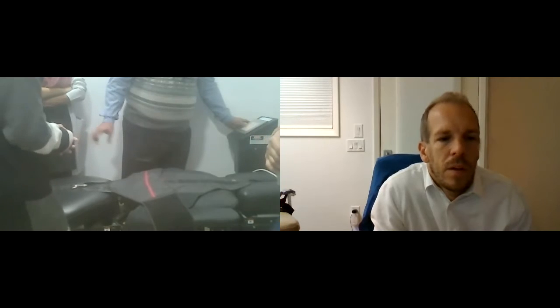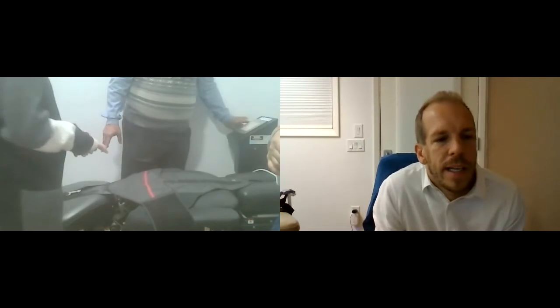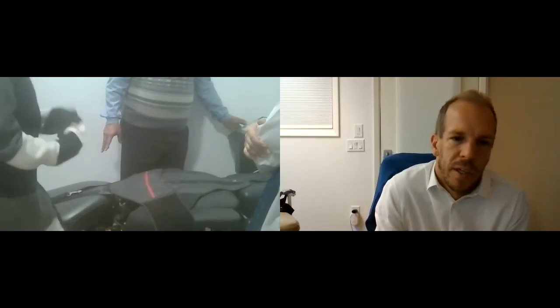Yeah, now it's going down. So if a patient was supine and you wanted extension, then you could put it in extension. If the patient was prone, then this would be prone flexion.